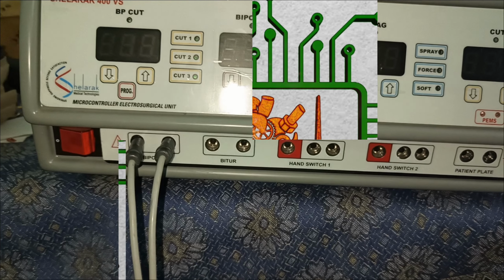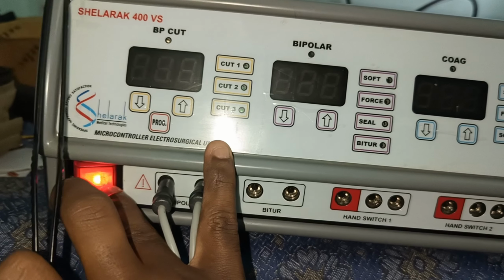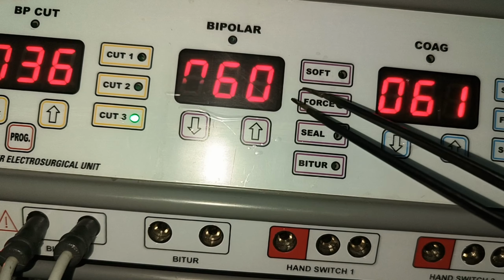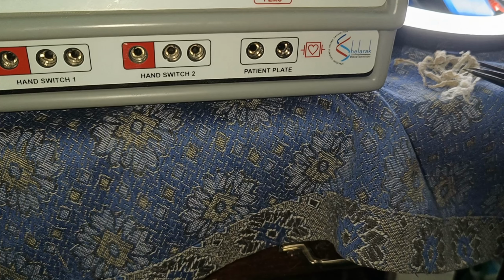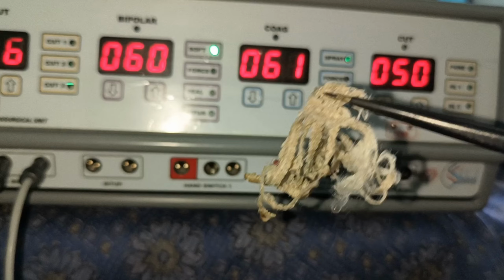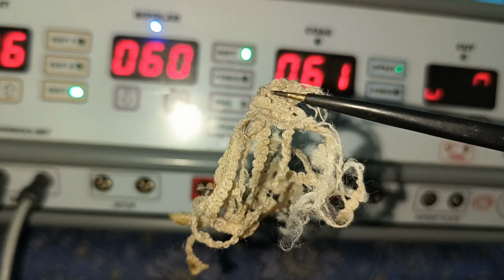Okay, so here we come with a problem in the bipolar shaft. Whenever we are switching it on, it is getting on, the shaft switch is coming and the readings are coming, but when I try to cut from the shaft option, it is not cutting nor coagulating.